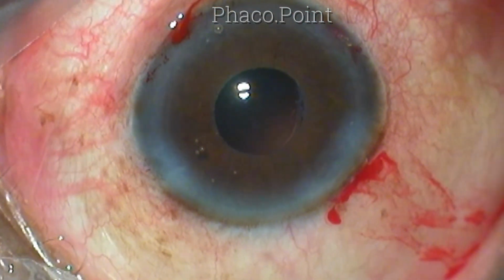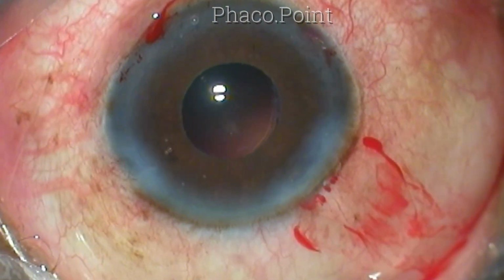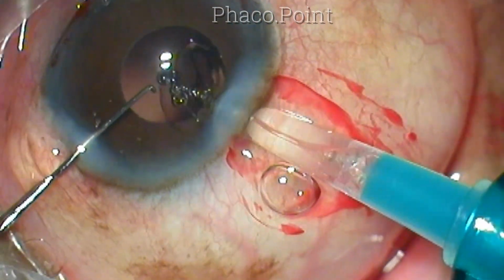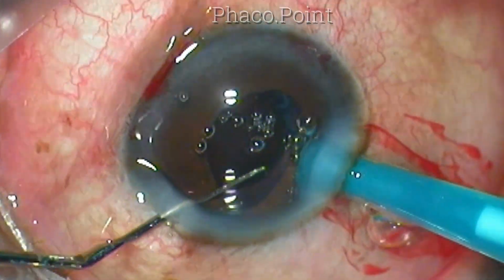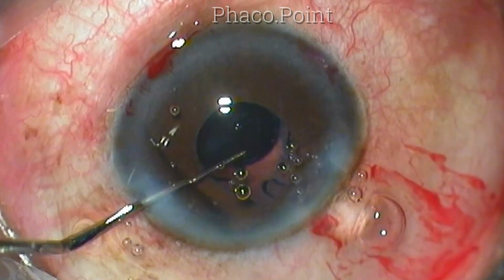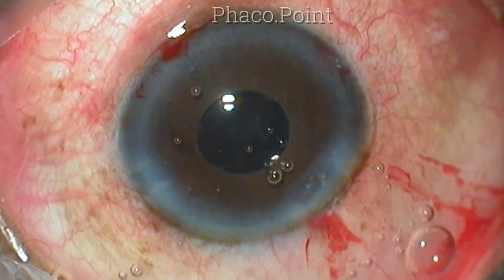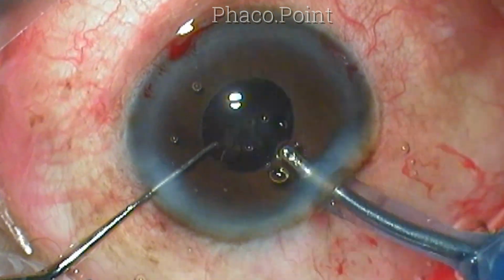I am more confident now that the capsule support is good, and this gives me a higher level of confidence to go ahead and complete the case with the implantation of a hydrophobic acrylic intraocular lens. The lens is injected so that the leading haptic gets into the capsular bag, and the trailing haptic can be simply tucked in. Because of the presence of CTR, the capsular bag withstood the slight stress of pressing the loop into the capsular bag.